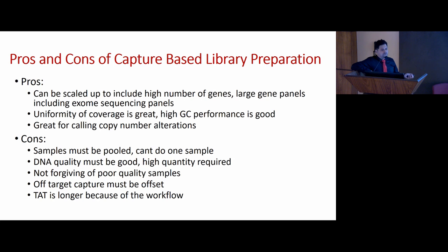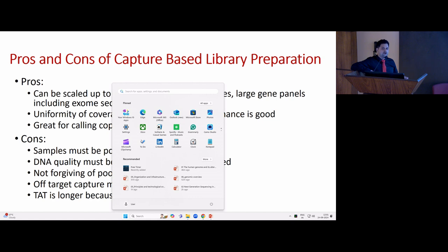You try to do this on a paraffin or you try to do it on a bone marrow trephine biopsy, and you will see what coverage you get. It will be miserable. Okay.